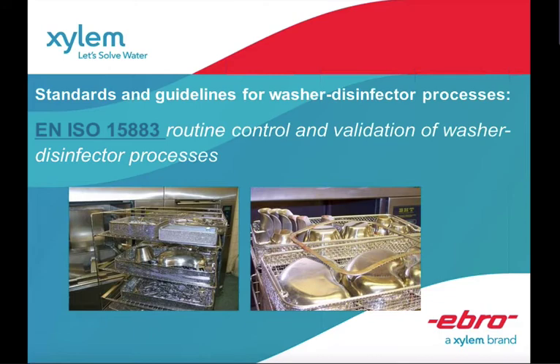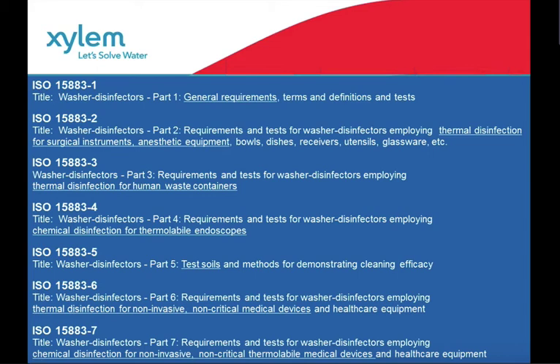EN norm 15883 is presented here in a brief presentation, in parts.